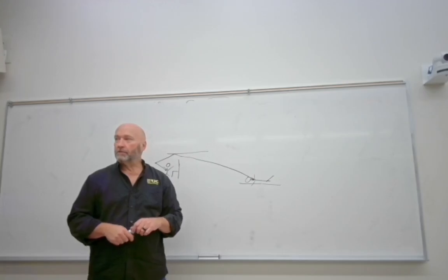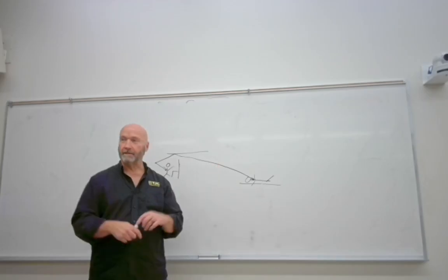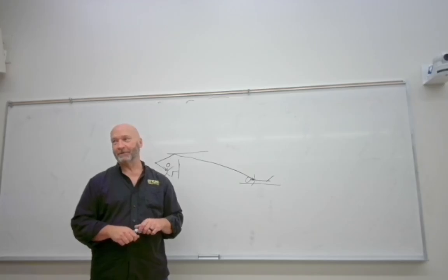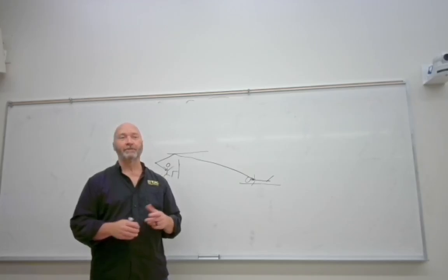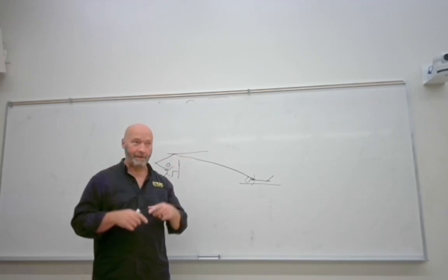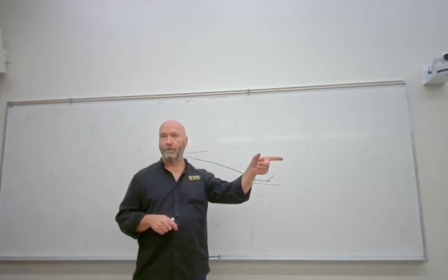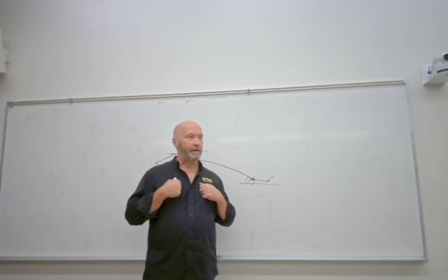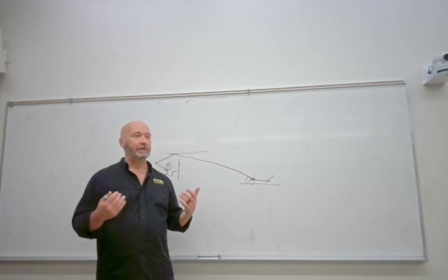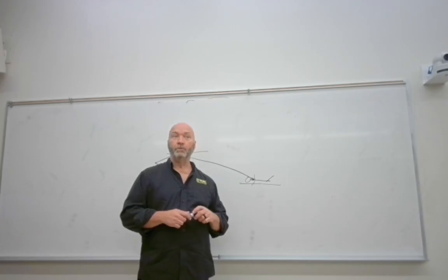And the machinery I used, I could not find any leakage radiation. I thought the protective housing is perfect, right? And I found out yesterday it's not. There's a lot of leakage radiation that comes out of the X-ray tube. Okay, so you're thinking maybe, well, the X-ray is pointing that way, right? You're doing portables. I've got my lead apron on. If I stand behind the X-ray tube, I'm not getting any X-rays because all the X-rays are going that way. And you would be wrong.